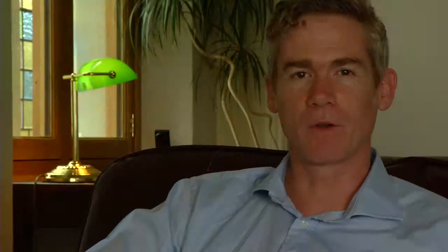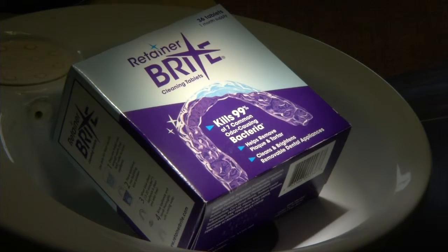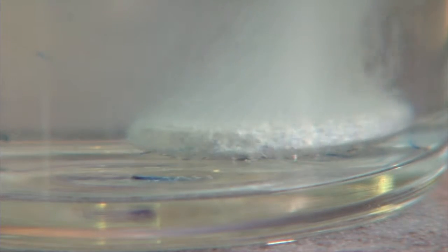After every meal, remember to remove your brace, clean it, and brush your teeth. Top tip: clean your brace over a sink full of water — then if you drop it, it won't break. You can use a brace cleaner tablet, such as Retainer Brite, to give your brace a really thorough clean.